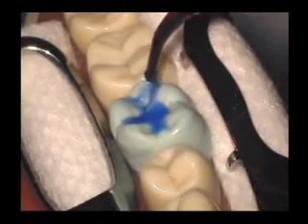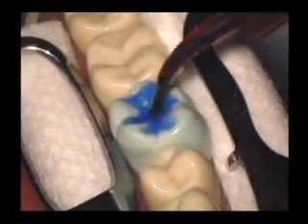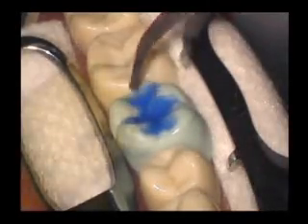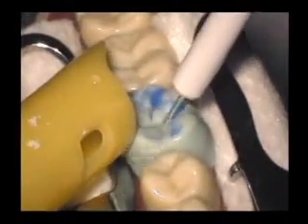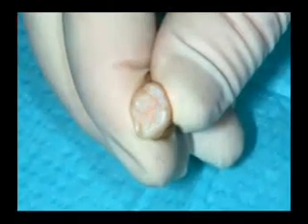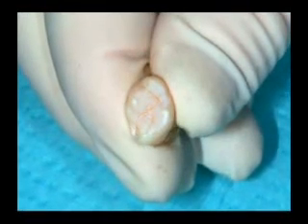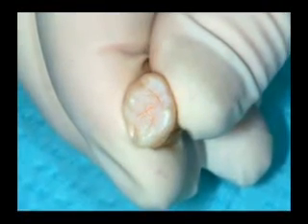A 35% Ultra Etch gel is dispensed over the area that requires sealing. Allow the gel to remain for 15 seconds. Thoroughly rinse the tooth for 20 to 30 seconds, followed by drying for several seconds. An extracted tooth is shown here so you may see a properly etched surface. Note the chalky frosted white appearance.